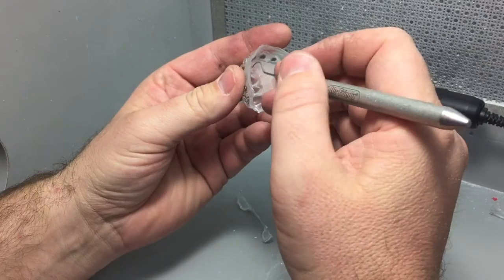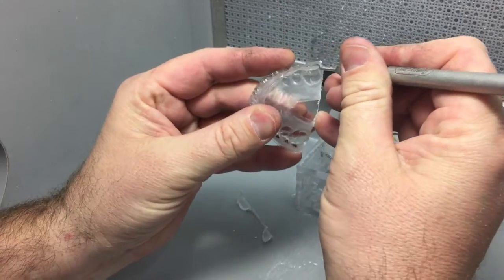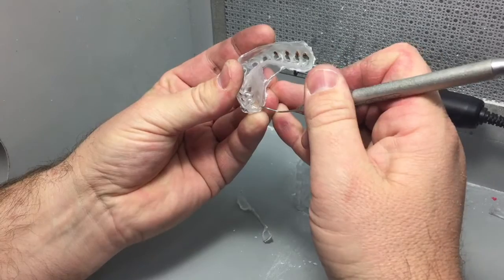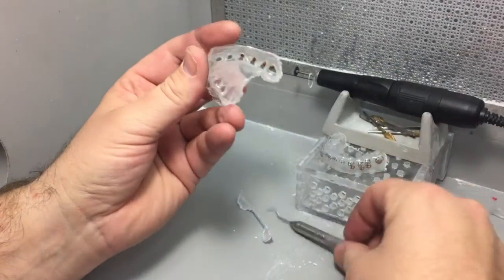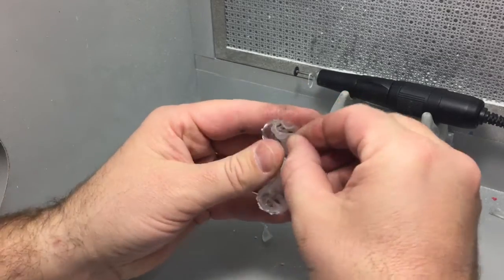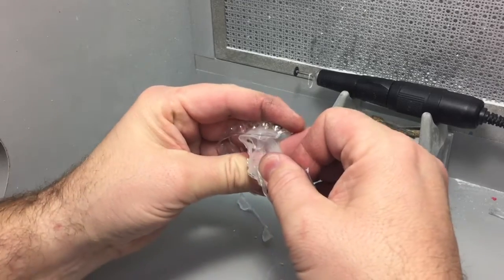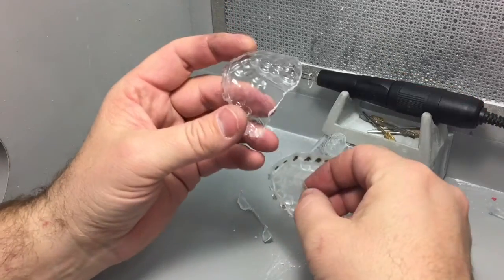Now we need to remove the inside tray from the outside tray. We'll use this tool to help separate them and break the seal. Then, without stretching the material, just kind of pry it out like this. There you have the inner tray and outer tray.